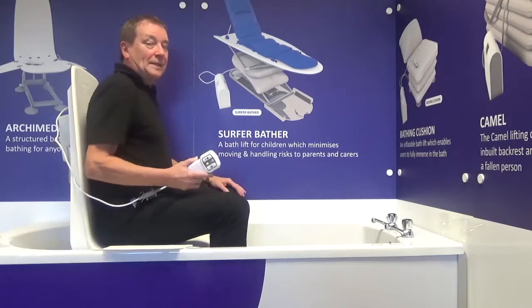Once I press the up button to bring the bath lift up, I can start to put the water into the bath. The water can be as deep as you like. Don't worry about only a small depth of bath. Have as deep a bath as you would want to. I back up to the bath lift, swing my legs into the water and sit nice and centrally. And at this point I do feel really secure.